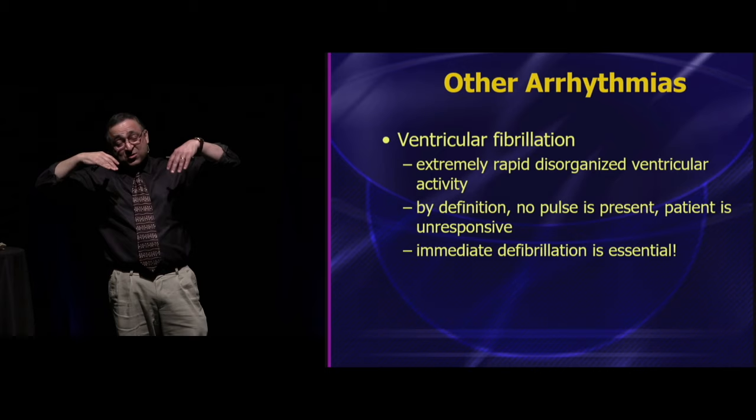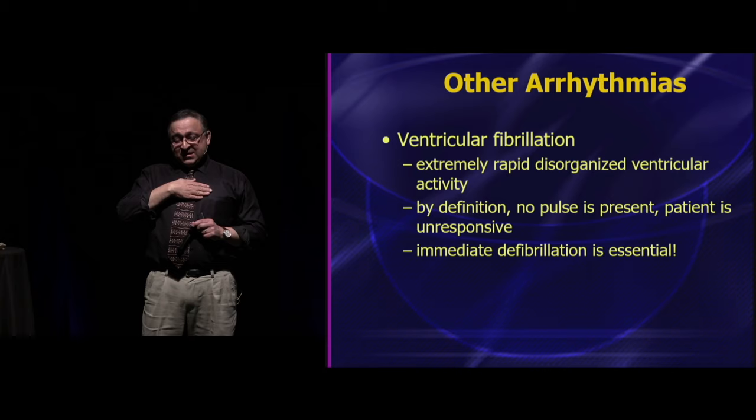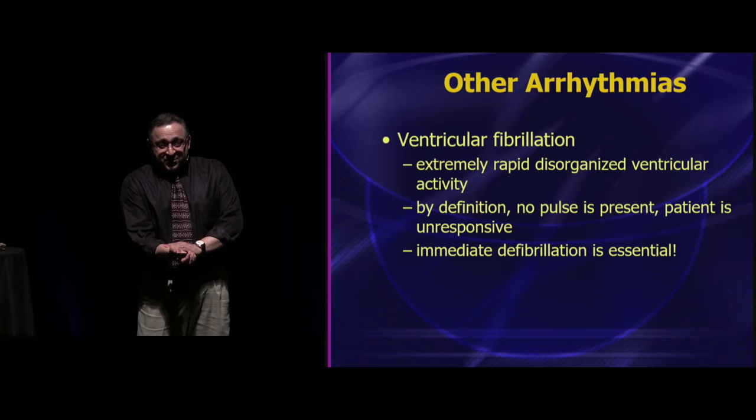So my senior medicine resident grabbed the paddles, went running over and shocked this poor guy who was simply taking a nap. One of his leads had come loose. This one's kind of jiggling a little bit. If we had simply checked for a pulse, we would have said, hey, he's got a pulse. It can't be VFib. But we didn't do that. So we never got Christmas cards from him.